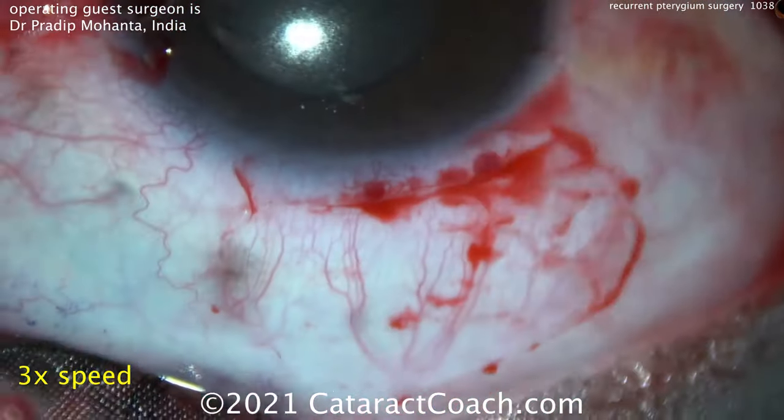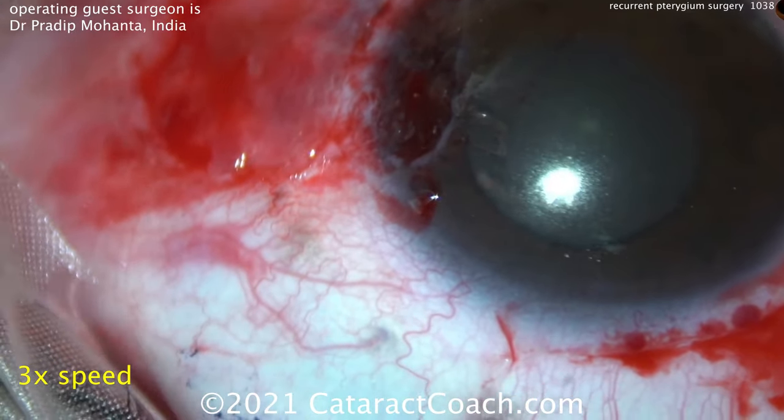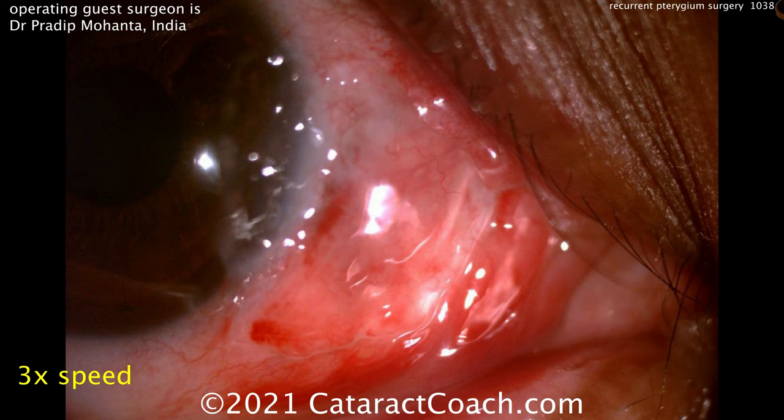Now this is going to stay. He's going to wait and then patch the eye for about 48 hours, then carefully remove the patch. Here are his post-op pictures — they look great. This is a neat technique: no sutures needed, very nice dissection. A little antibiotic placed at the end. Here's the post-op appearance — wow, that looks beautiful. Thanks for the great video.